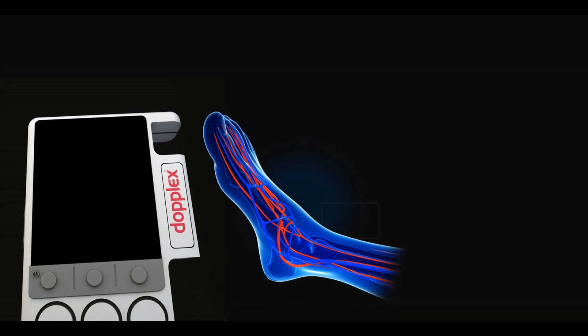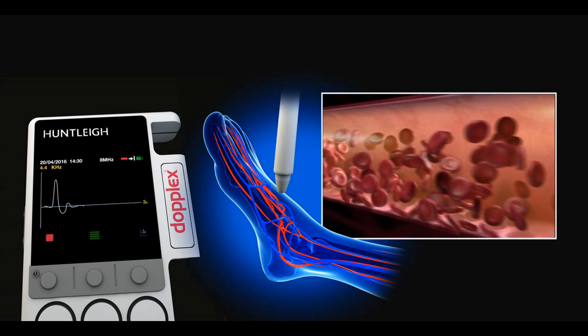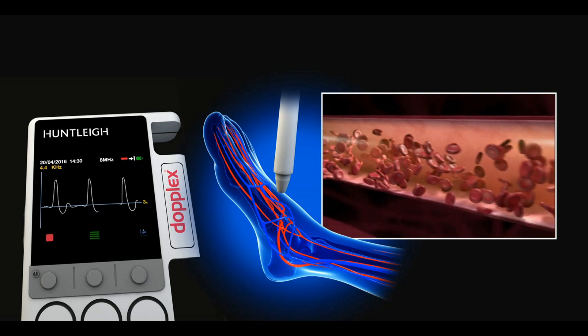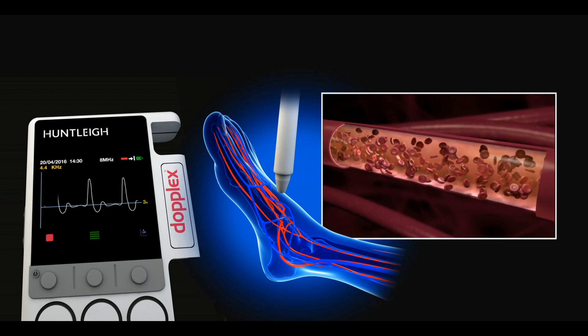Holding the probe at about 45 degrees to the vessel, the Doppler generates an audible sound and the waveform on the screen shows a direction of flow. In a healthy person, the arteries in the ankle have blood flow in the forward and reverse direction.